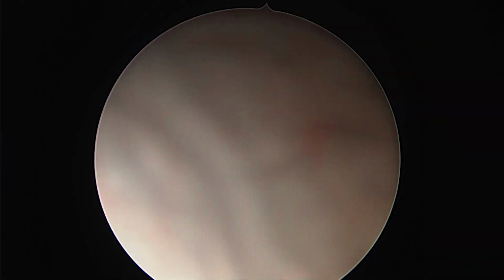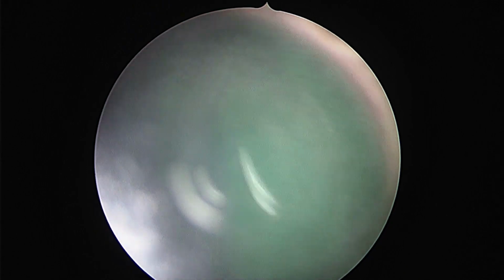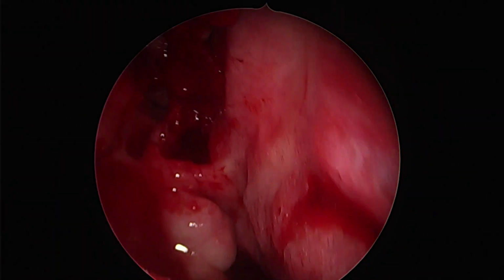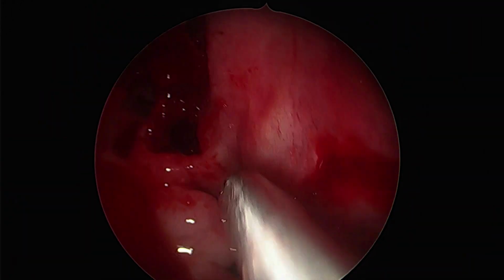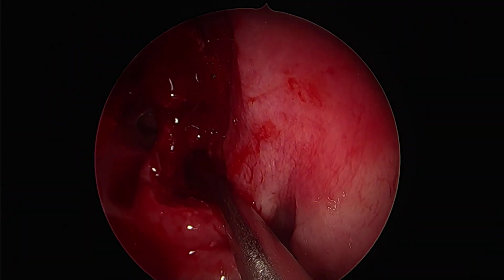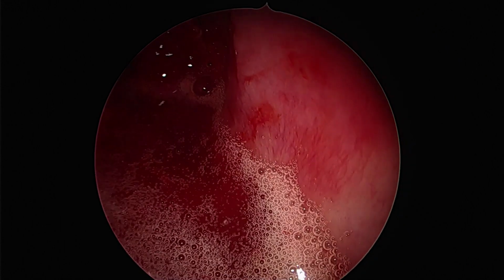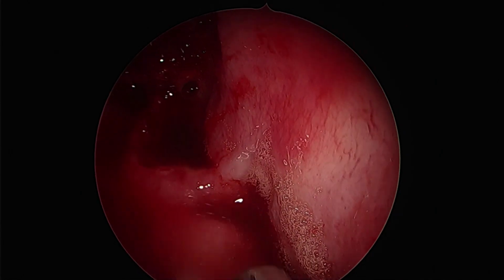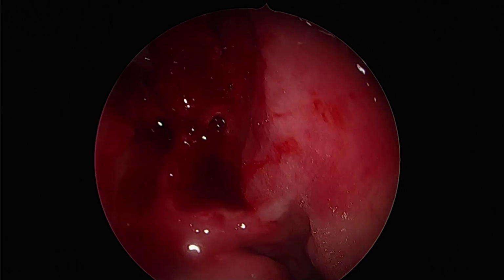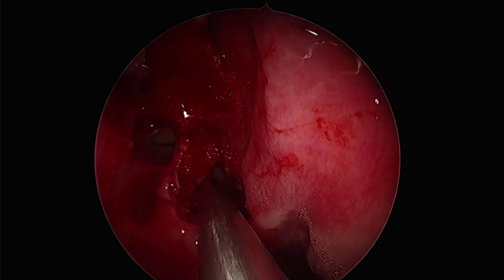One can use a downward biting punch or an upward biting punch upside down. Both work equally well for this step. Irrigation with warm saline or Ringer's lactate at body temperature helps in achieving a good surgical field and hemostasis.